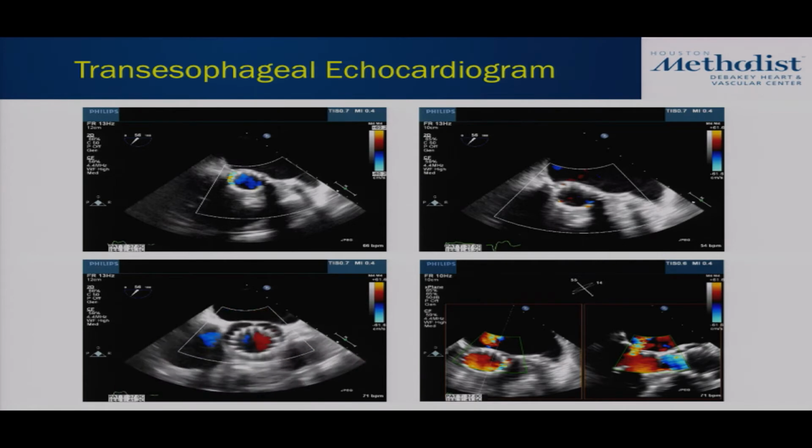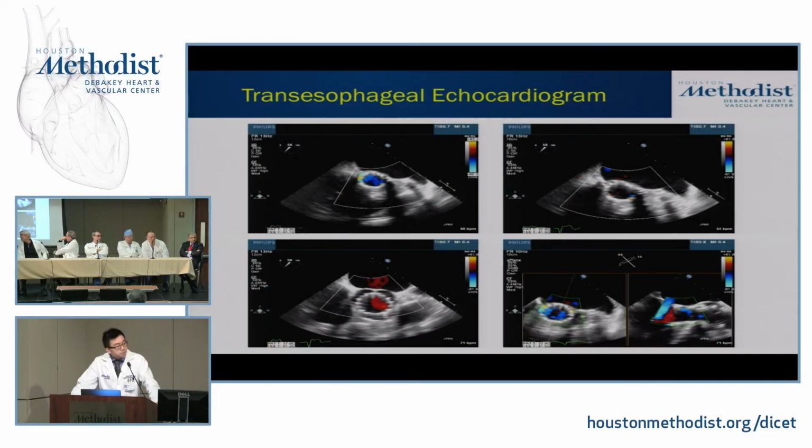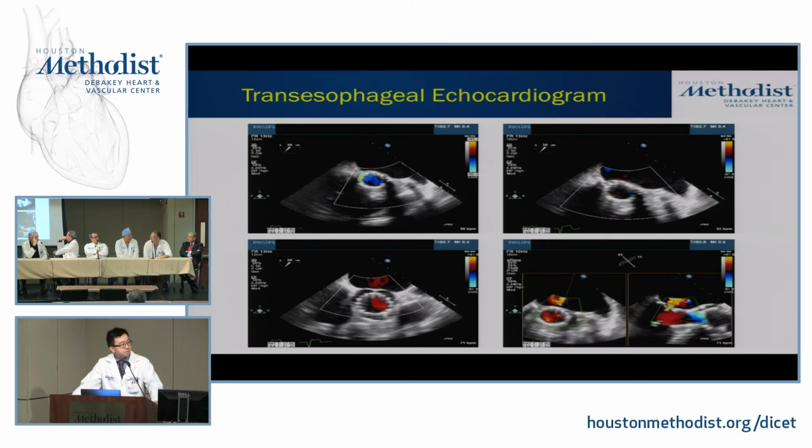I mean, it's clearly very, very low. I didn't see the images immediately post-procedure, but the leak is because it's low. There's nothing sealing. There's essentially chicken wire at the annulus, so there's no material there to seal, so that's just wide open PVL. There's no skirt there. I don't know if it moved or if it was left this way.